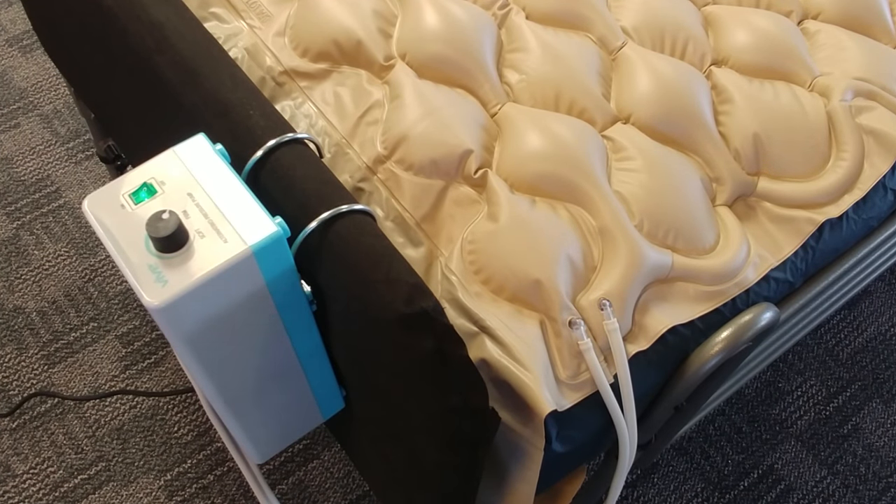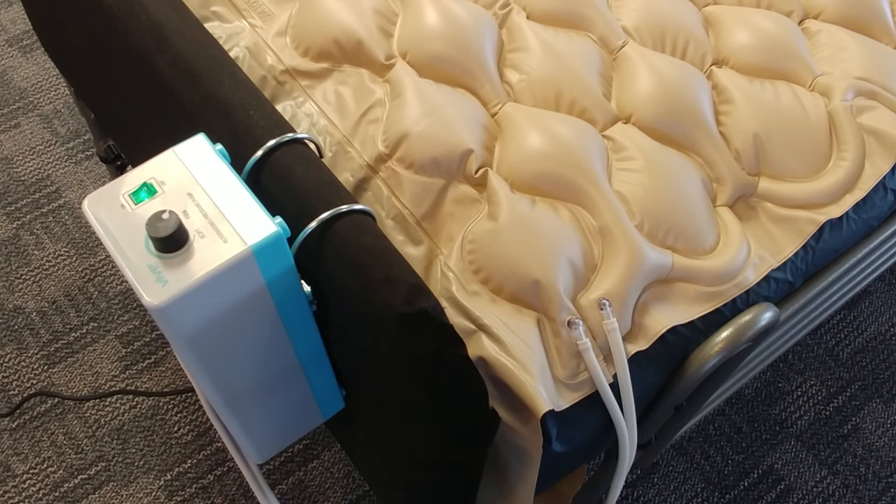This is just going to be a quick video on setting up the Vive alternating air pressure mattress. I've got it set up right now and I'm just going to walk you through all the steps. It's a very simple setup with just a few pretty simple procedures.